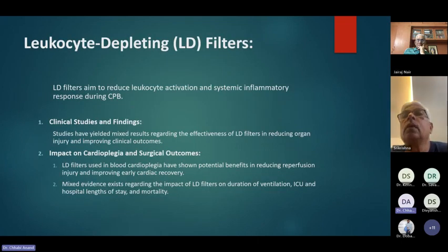Leukocyte depleting filters. LD filters aim to reduce leukocyte activation and systemic inflammatory response during CPB. Clinical studies and findings. Studies have yielded mixed results regarding the effectiveness of LD filters in reducing organ injury and improving clinical outcomes. Impact on cardioplegia and surgical outcomes.